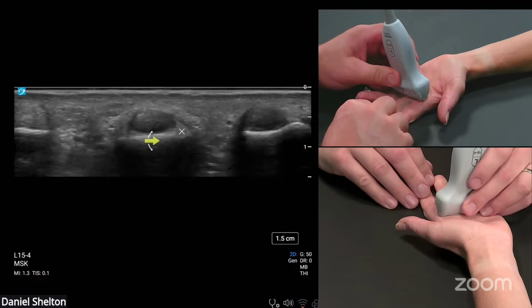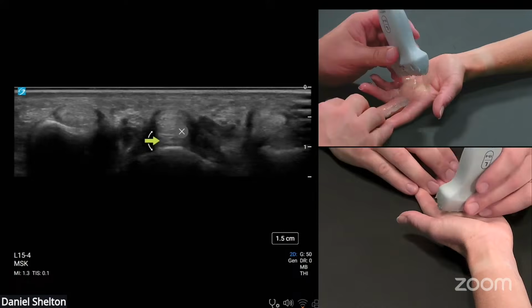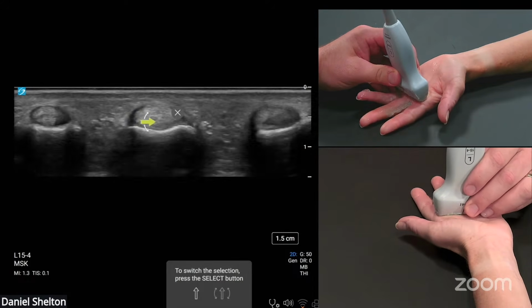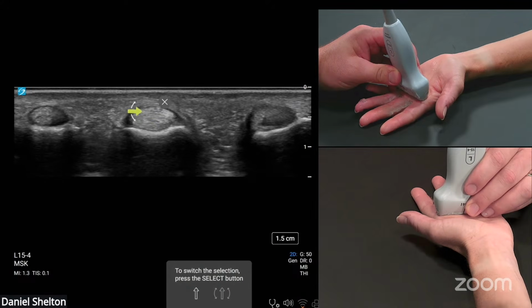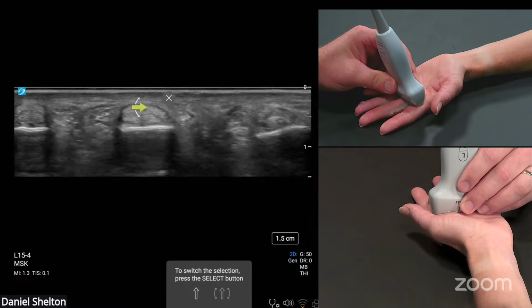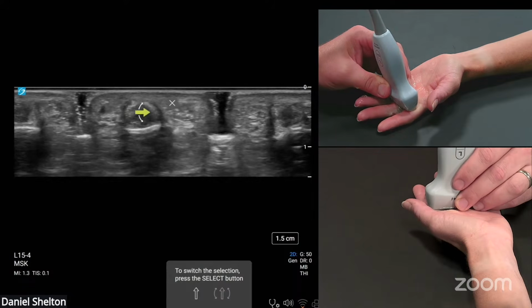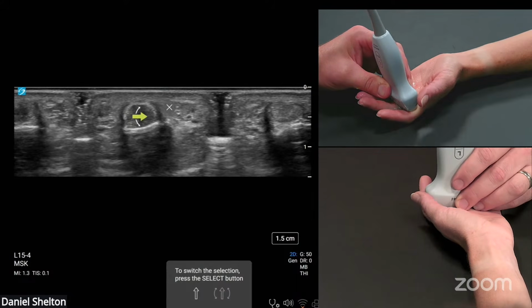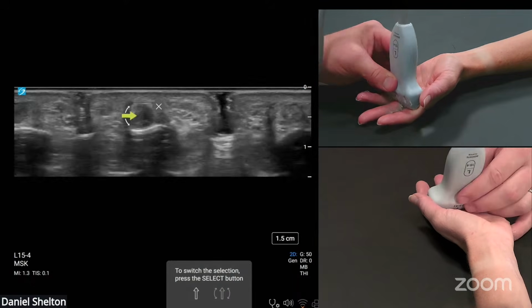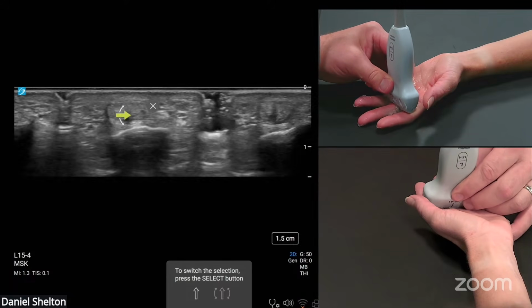I'll go cross-sectionally, and let's watch them kind of switch places like we did in the PowerPoint slide. So when I'm proximal, I've got two layers of the tendon, kind of a hemisphere, profundus, superficialis. Superficialis at this point will split vertically, and we start to see the two heads of superficialis go on each side of profundus. Profundus changes its echo texture here because it's changing direction. It also changes its echo unless I were to rock the transducer. So if I rock the transducer to match it, they start to look the same.